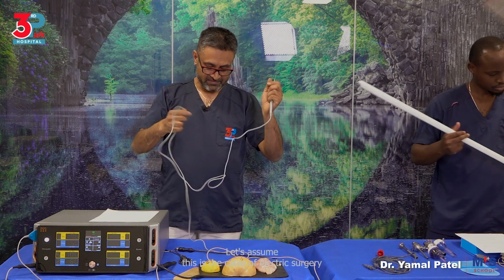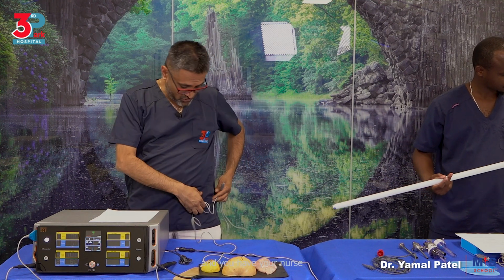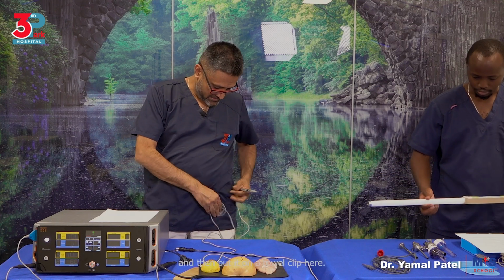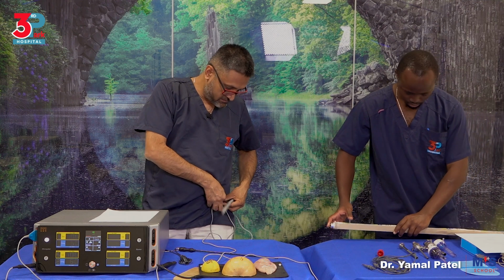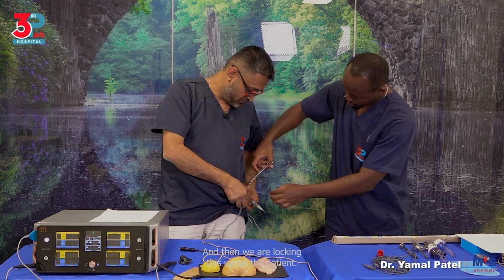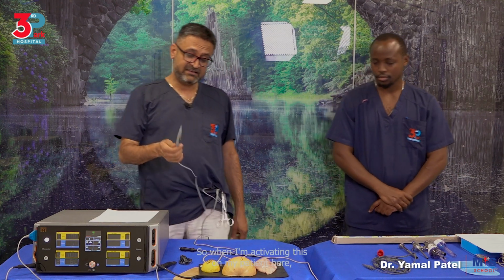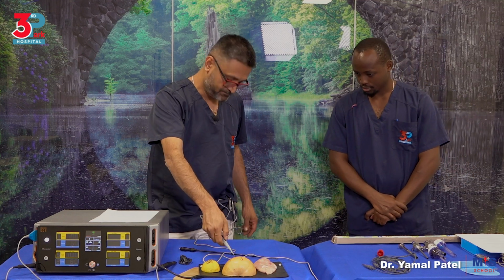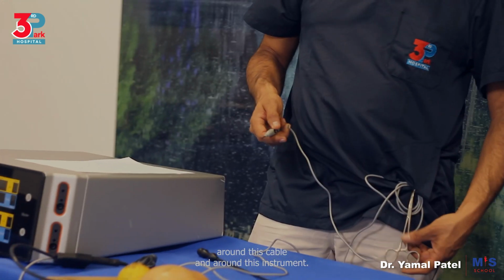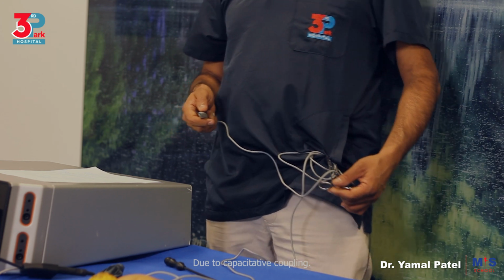So when you have something like this, in practical aspects, what do I mean? Let's assume this is the cable of electrosurgery, and you have your nurse go and wind it up like this, and then put it on a towel clip here, okay? On a towel clip here, and then we are locking this up on the patient. So when I'm activating this on my patient here, there is electricity collecting around this cable and around this instrument, okay? Due to capacitive coupling.